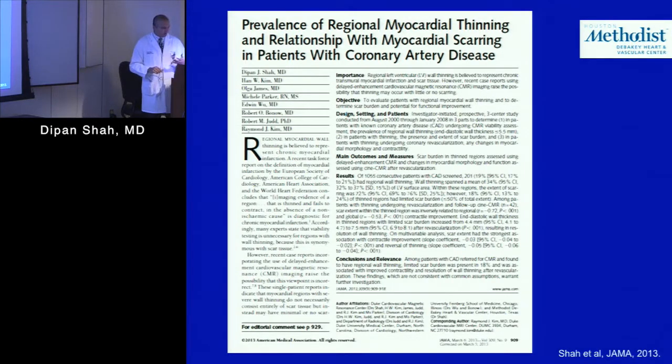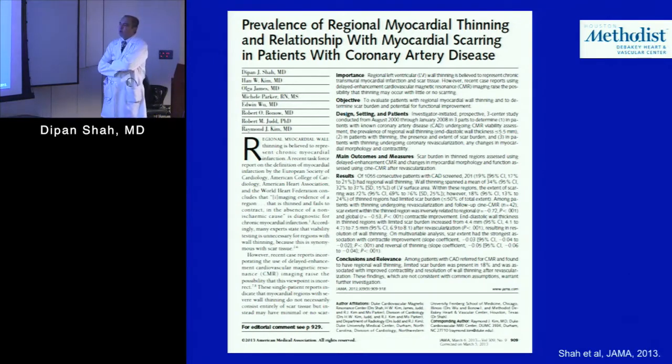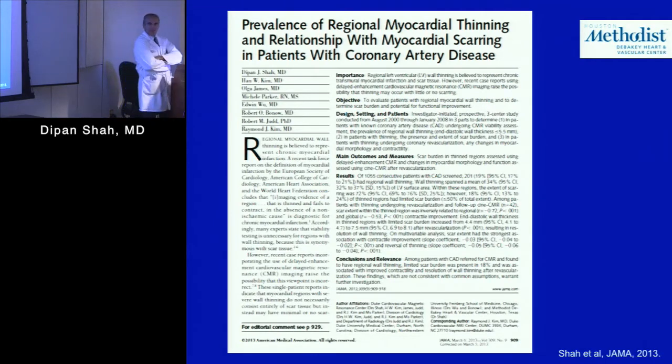And I think one of the things we looked at was in that first example where I showed you wall thinning. The traditional thinking had been that if you have significant wall thinning, then a priori there can't be significant viability. Then this area must be infarcted and fibrosed.